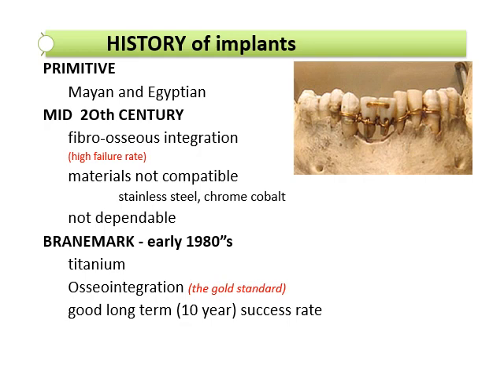Osseointegration is now the gold standard for dental implant success. Basically, bone integration, bone surrounding the implant fixture, keeps it stable and sturdy. Implants are proven to have a 10-year success rate, if not more now, with technology and the way we handle dental medicine.